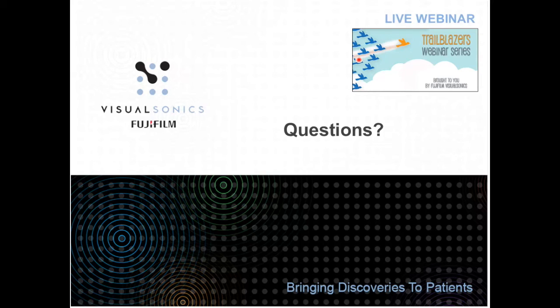But with the help of photoacoustics, you get light into tissue and get an echo back. So you can use this to visualize endogenous contrast, as we saw before, for example the blood, or clinically approved contrast agents such as methylene blue, which works fantastically for photoacoustics, or ICG, as shown before. So there definitely is great potential in that direction for both modalities.